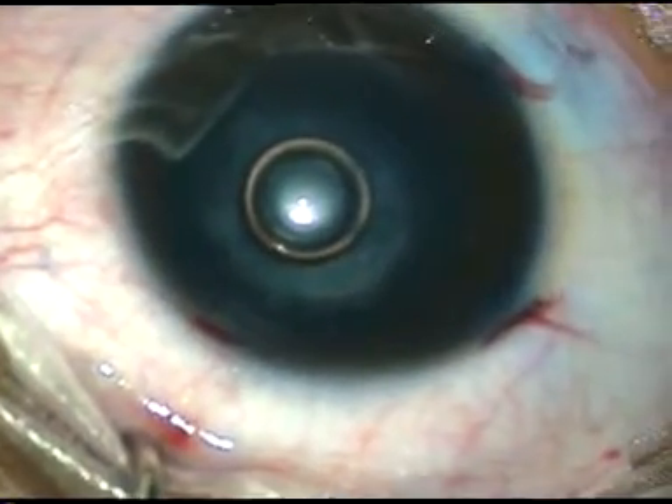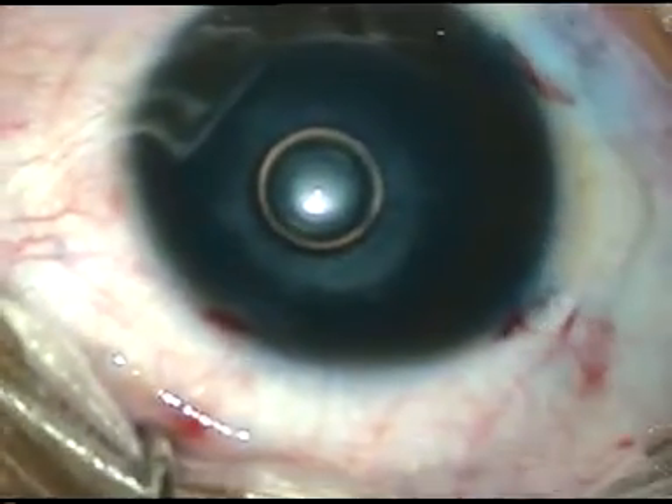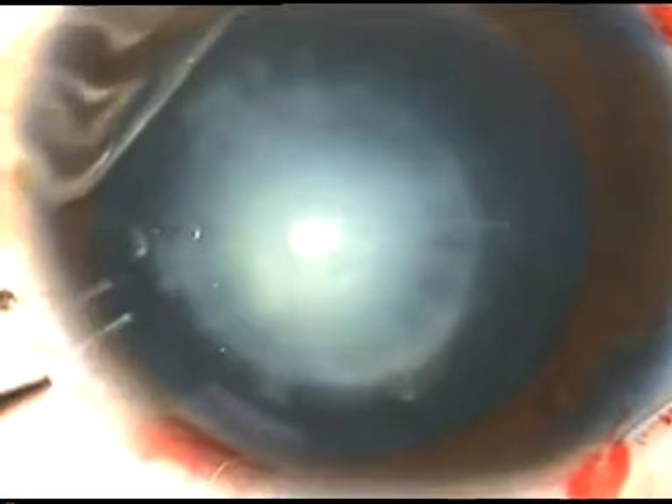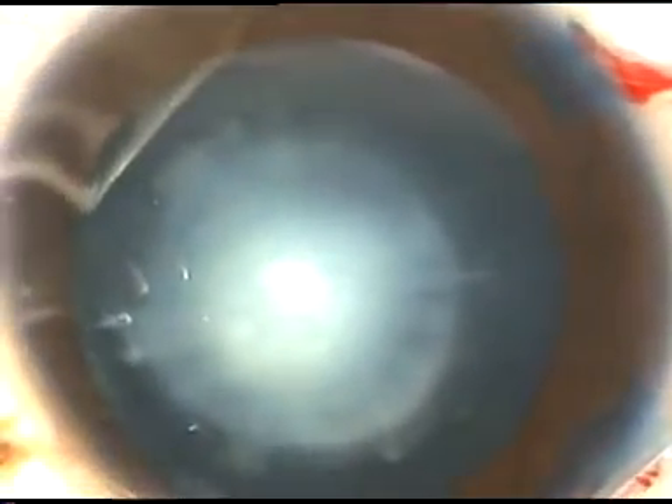Viscoelastic substance is injected into the anterior chamber. I am using HPMC — hydroxypropylmethylcellulose — a non-cohesive viscoelastic substance. And now capsulorrhexis is being done.